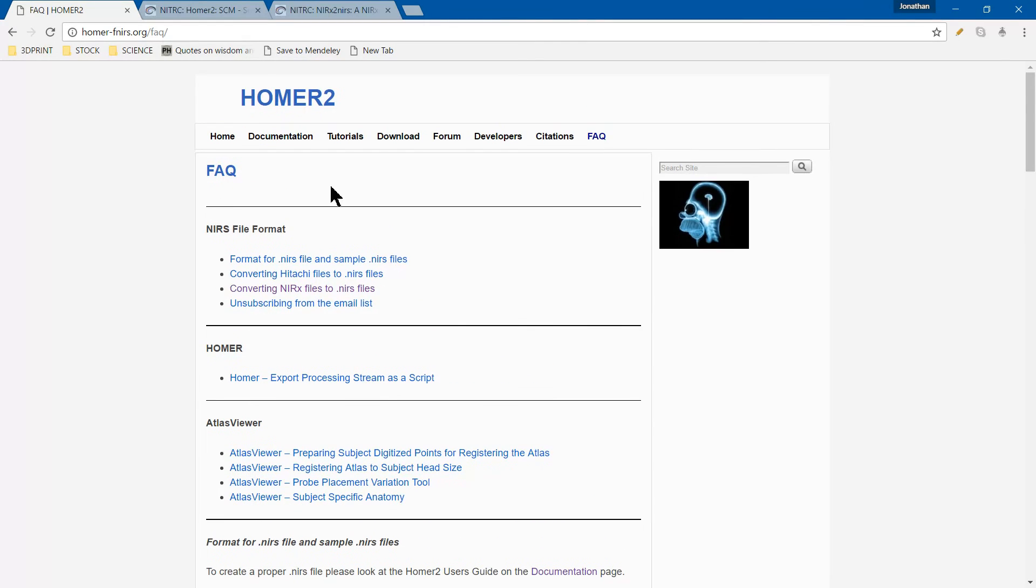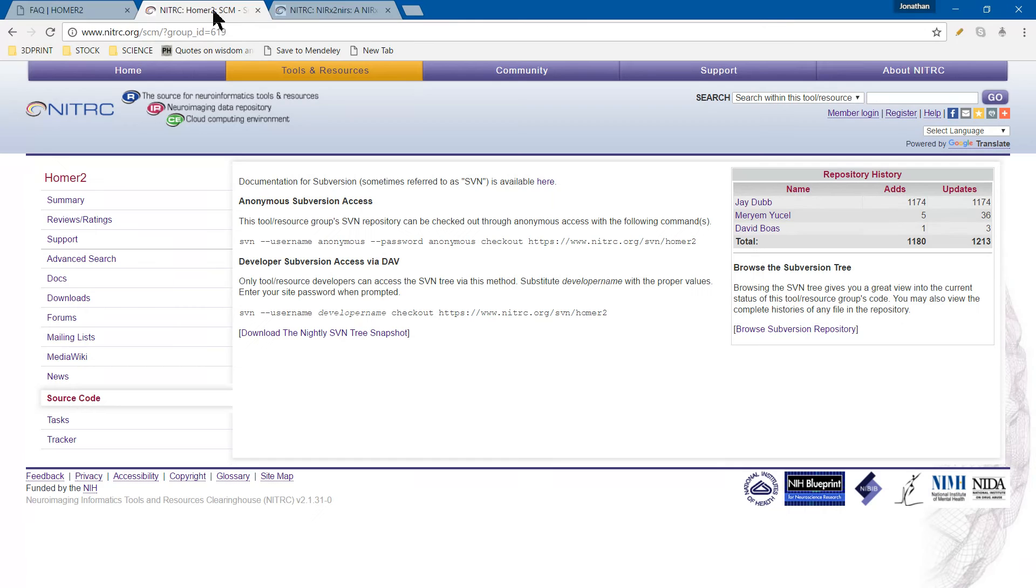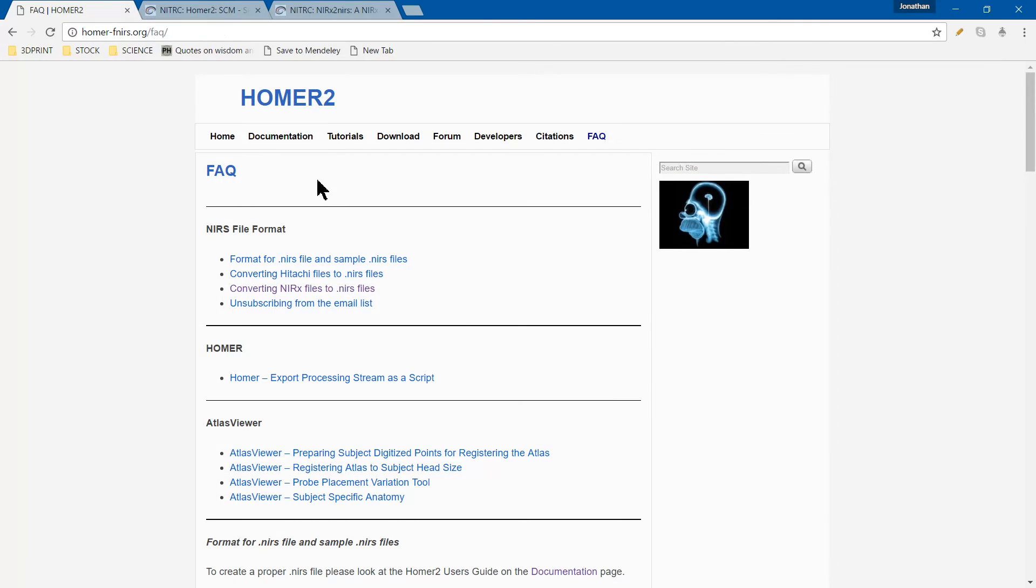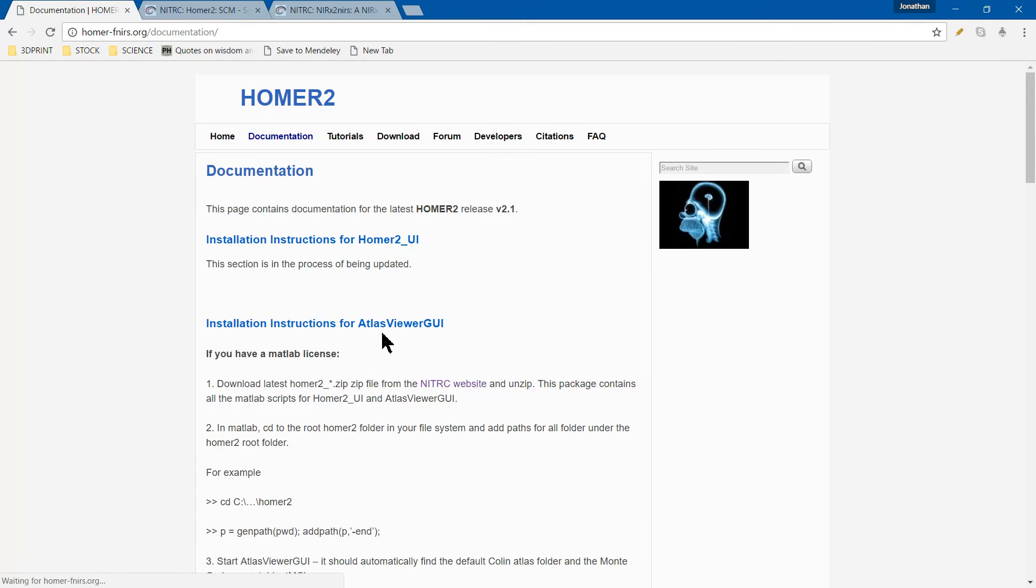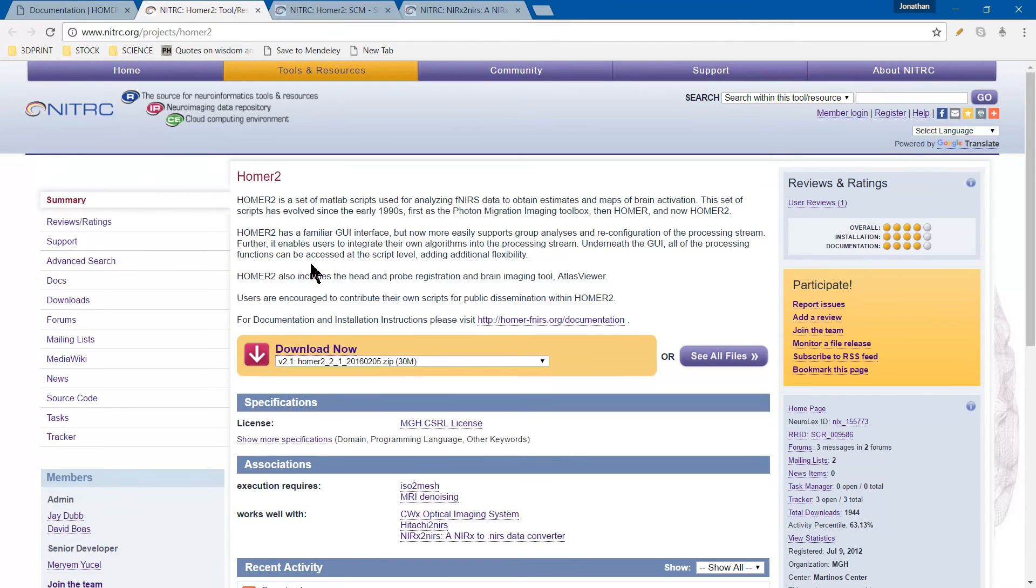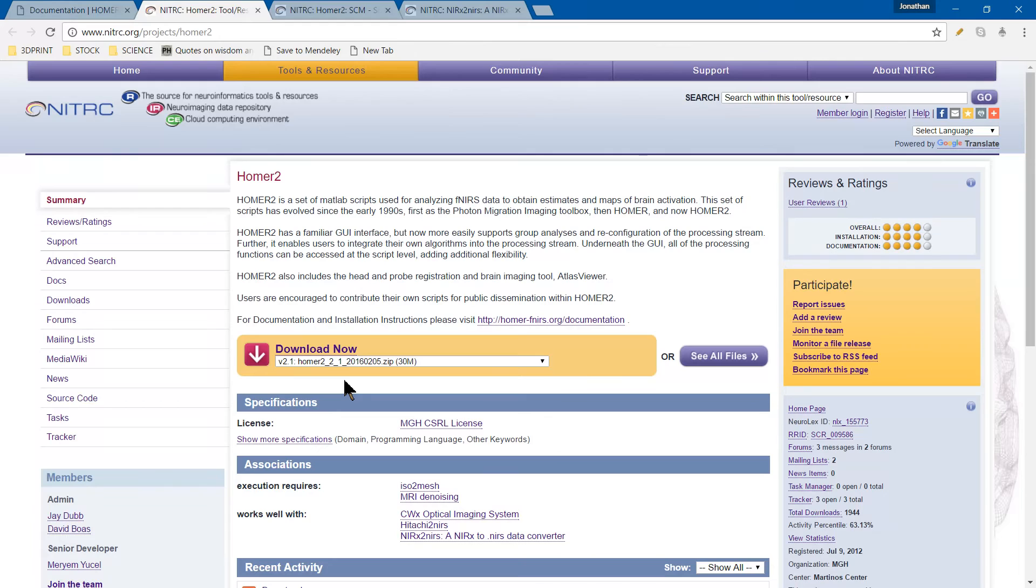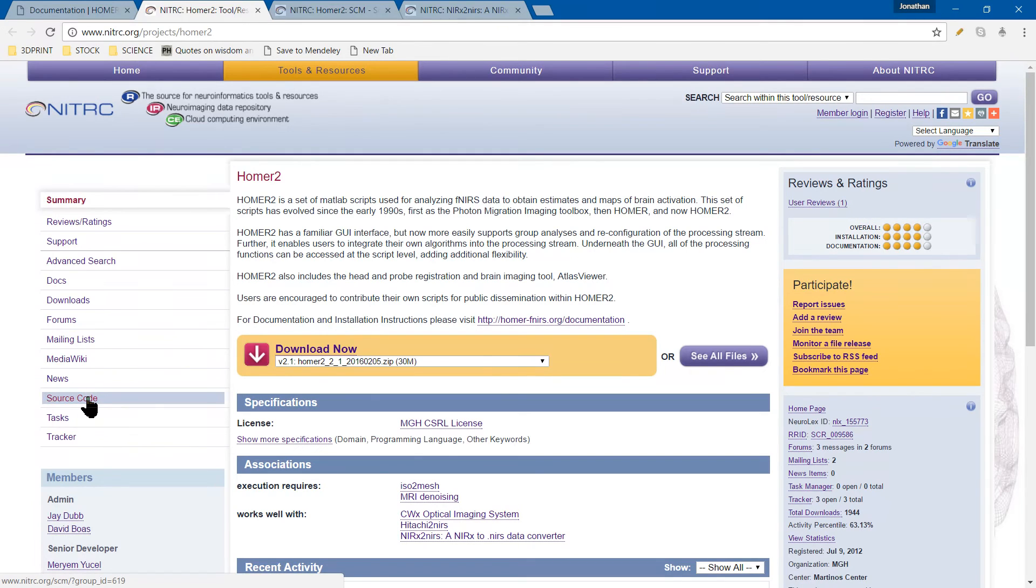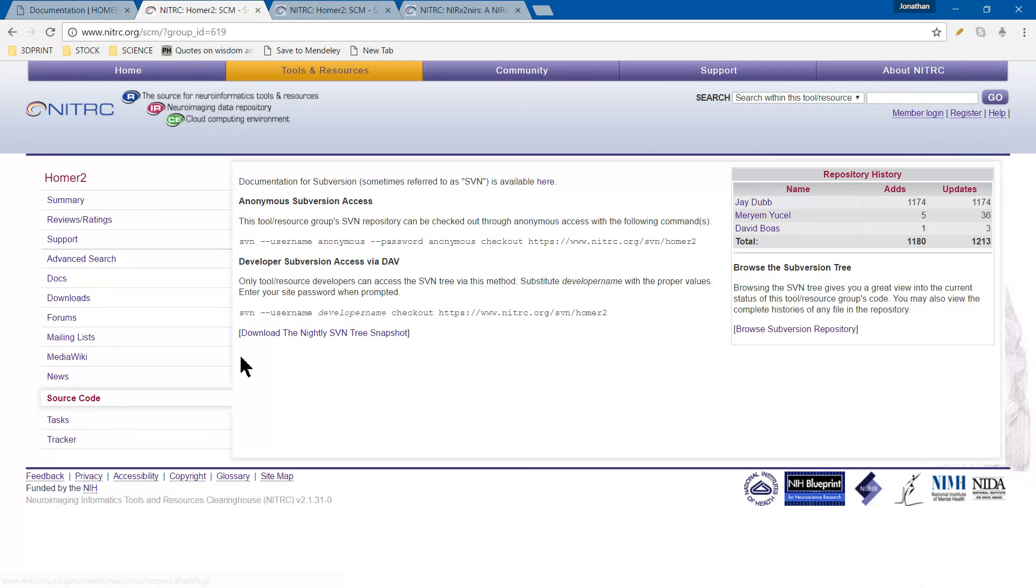Once you have that, we can go to the download page using the link here. The download takes a handful of minutes, nothing terrible. Once you get it, it comes with the entire package and you'll need to unzip it. If you ever need access to the source code, it's right here in the corner. Just click source code and you'll have to sign in.